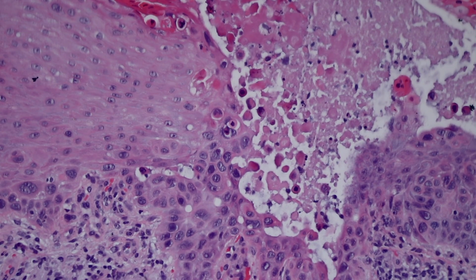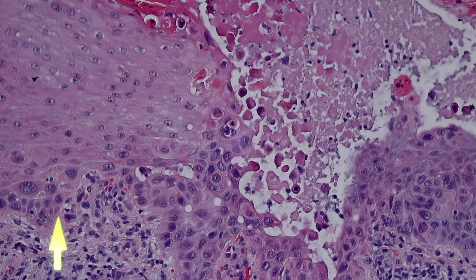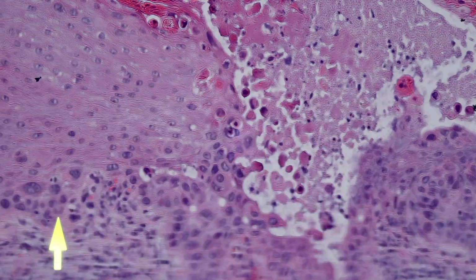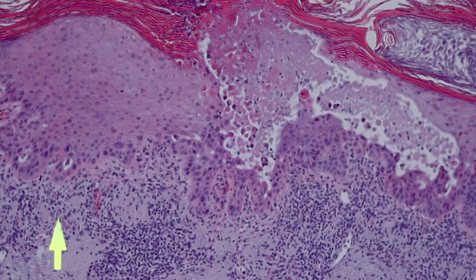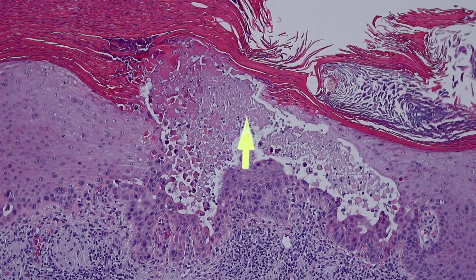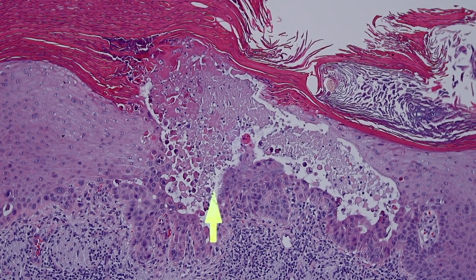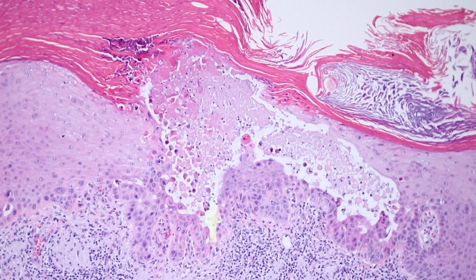You can have acantholysis in a variety of benign and malignant and premalignant keratotic lesions. So in this case, I don't think that there's full thickness atypia or anything else to call this squamous cell carcinoma in situ. We do see acantholysis sometimes in actinic keratoses. I think it becomes a little more challenging, though, when you see this pattern, to know if there's full thickness atypia. Because look, from here, it's hard to tell. How do we know if there's full thickness? Because the rest of the epidermis above here is gone. So in areas where you have either acantholysis or excoriation or ulceration, it can sometimes be challenging to tell if there's full thickness atypia.